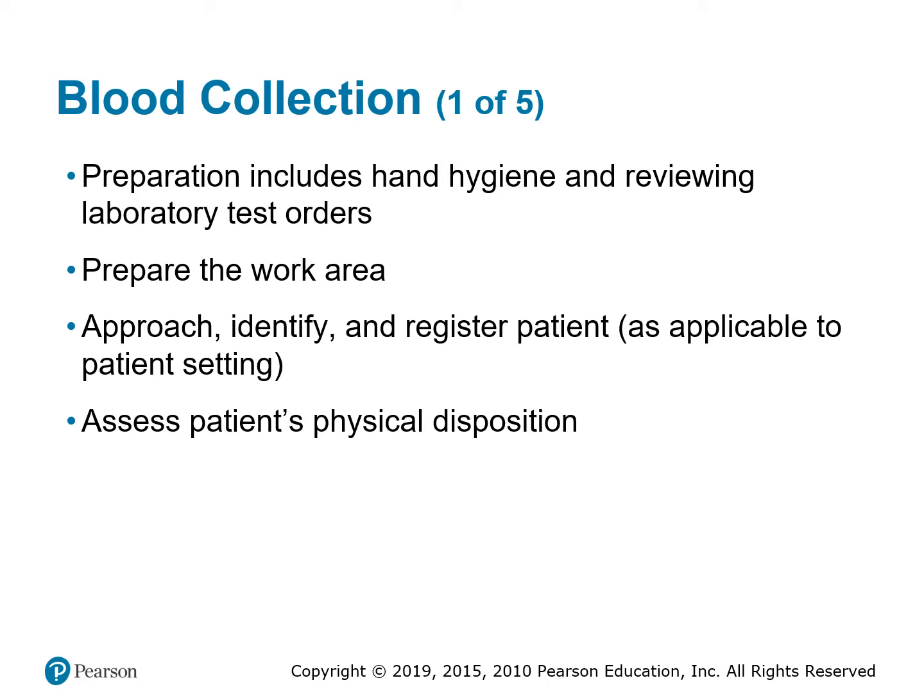Now, I know I teach y'all to wash your hands and to put on gloves before you even touch a patient. That is proper protocol. That is the way I was taught, and that is the way I'm teaching y'all. Now, I know some of y'all have had lab work done at other places by other phlebotomists, and you have seen them palpate for a vein or touch your person with just their bare hands, and then they put on gloves. If this is the case, they're supposed to wash their hands before they even touch you with their naked hands, and they're supposed to wash their hands again before they put on gloves, and then they have to wash their hands after they take the gloves off. So that'll be 3 times they wash their hands, technically. But I tell y'all to wash your hands, put on your gloves, touch the patient, get your equipment together, and it's all in a sterile environment because you have the gloves on.